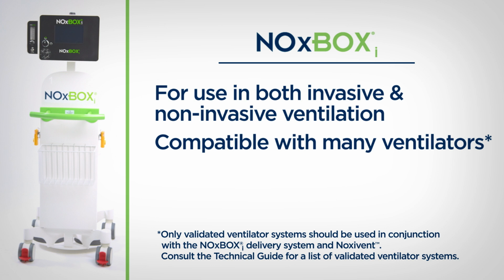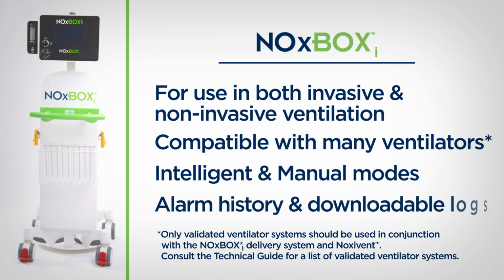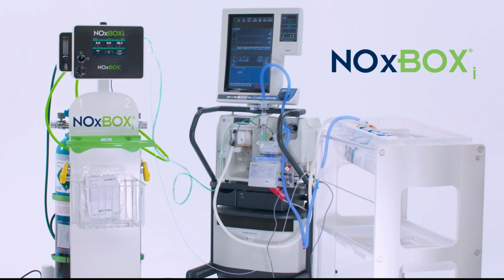The NOxBOXi system also comes equipped with both intelligent and manual mode options, so therapy can be delivered manually in case of a power or system failure. The NOxBOXi system collects usage data, including a full alarm history for up to 2 years of use, which can be downloaded via USB. The NOxBOXi device is a computerized closed-loop control system.